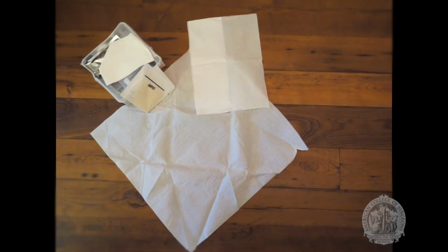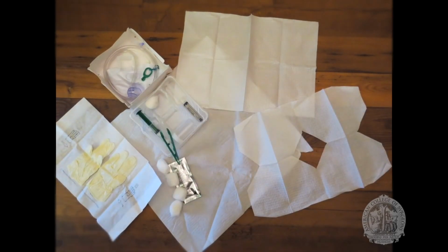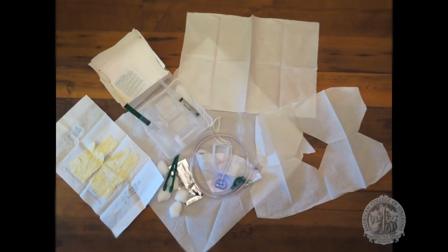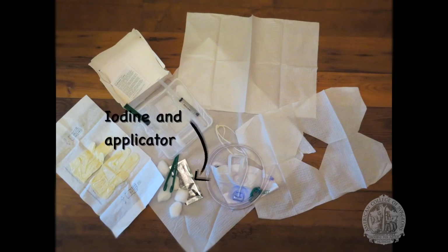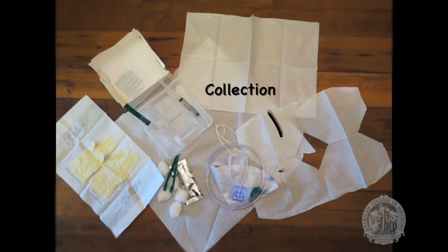Sometimes the catheter is packaged separately, as with this kit, so make sure you're choosing the right kit. In addition to the catheter, you'll need cleaning towelettes or soapy water, non-sterile gloves, absorbable pads, sterile gloves, a fenestrated drape, betadine or iodine with applicators for preparing the patient, lubricant, a sterile syringe with water or saline, and a collection system.